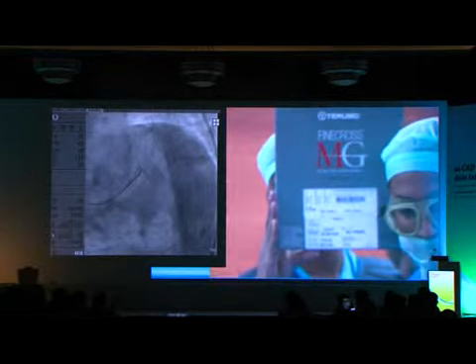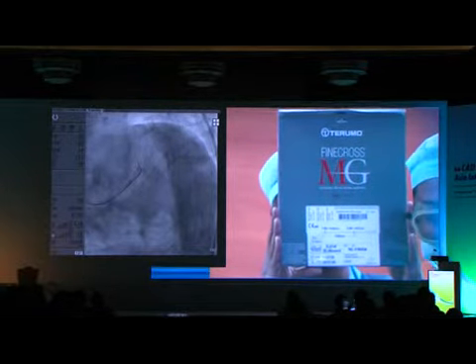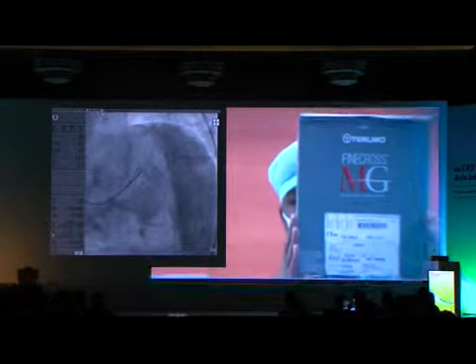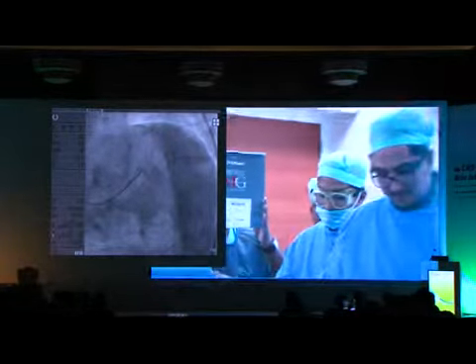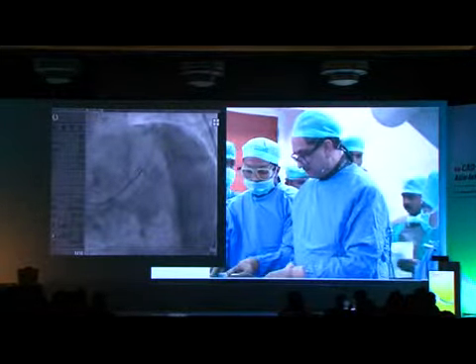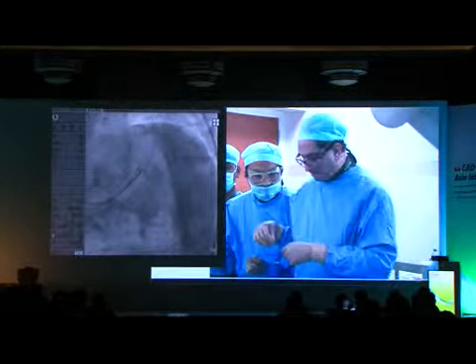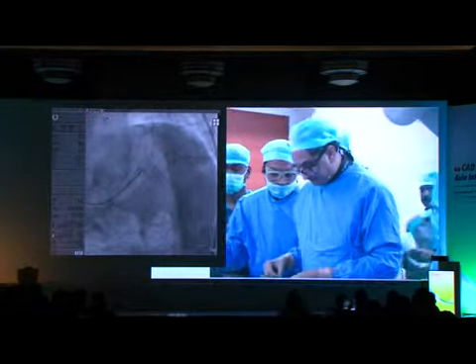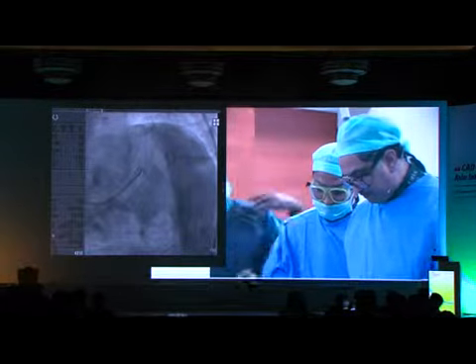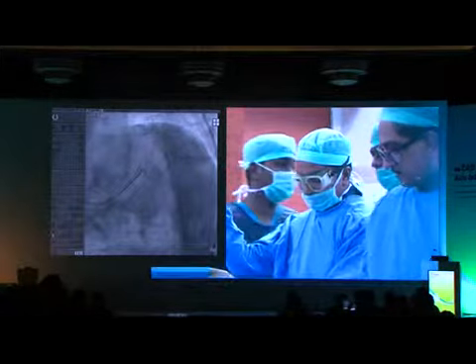So I think the best is to take everything off, to enter the wire in the Fine Cross. If not, if we push, we will prolong it. One back flow. Right. And retry with the support, because you see the wire alone was not enough.